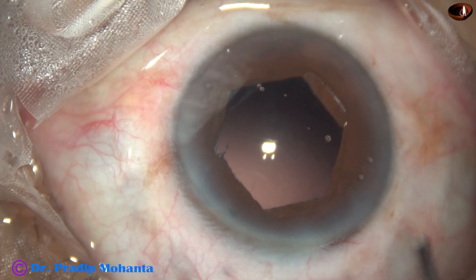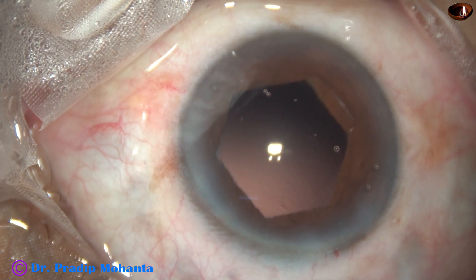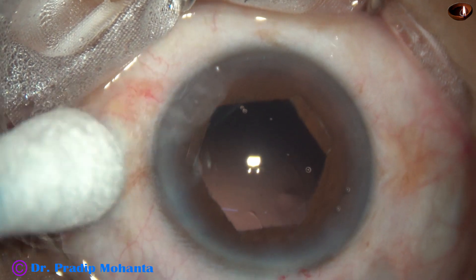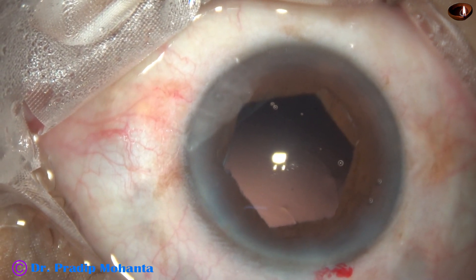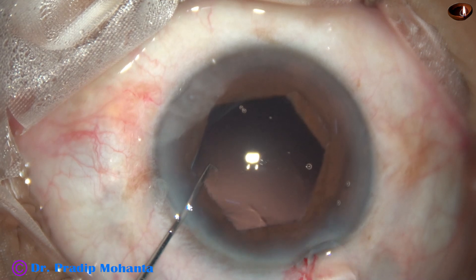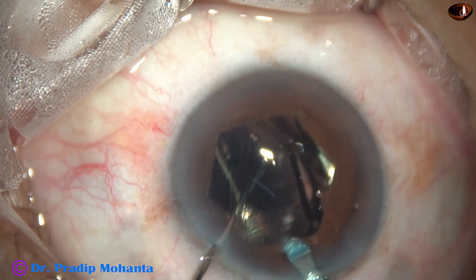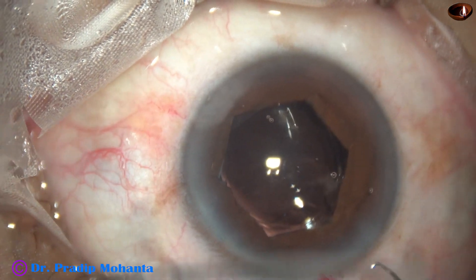We have now reached the point where we can implant the intraocular lens. Visco is used to fill the anterior chamber as well as the capsular bag. The wound is enlarged a little bit, because the tip of the cartridge should be beyond the flange lying over the iris just in front of the main wound, so that the trailing haptic doesn't get entangled with the dilating device. The IOL goes beyond the B-Hex ring and is placed in the capsular bag.